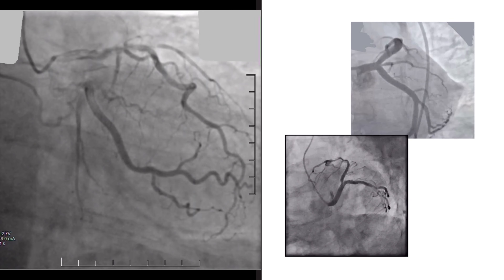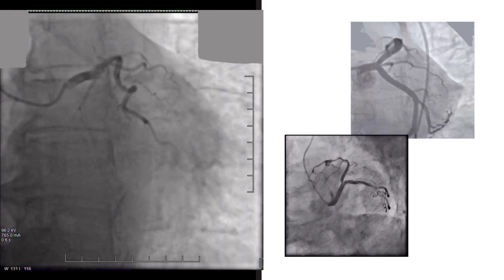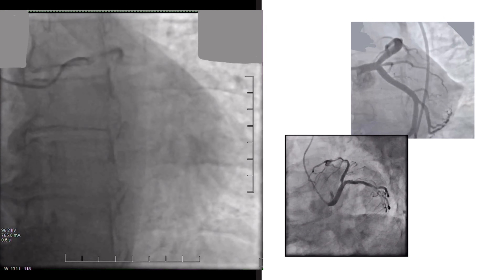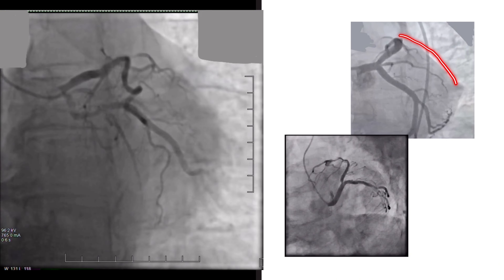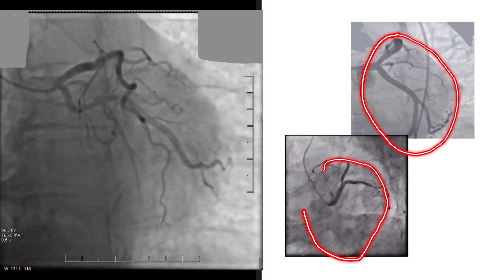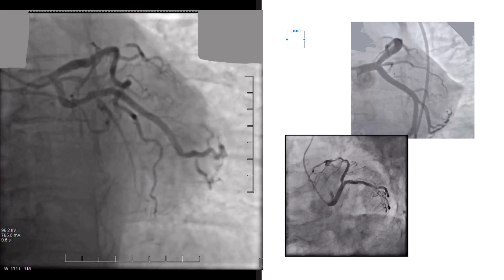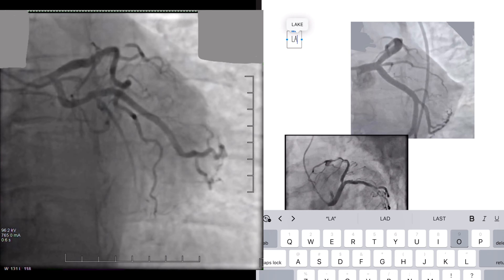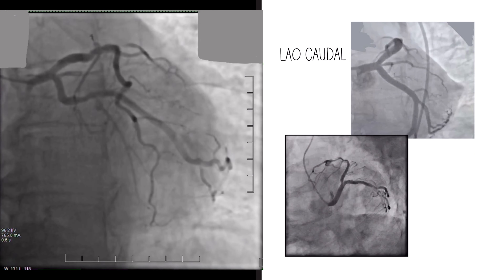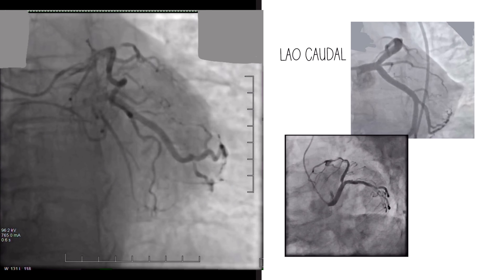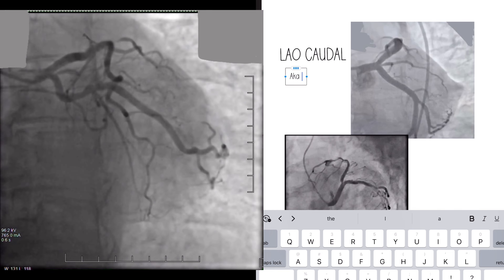Next example: spider view is a little harder to identify just because it's such a unique view, but we're going to try it anyway. Looking at this image, can you see the heart shadow? So that's the heart shadow in LAO. Spider view is LAO Caudal — it's one of the only views we really have a nickname for, which is why it's important to know what spider view actually means so that when you're asked, you don't wonder whether spider is LAO or RAO. It's LAO Caudal, also known as spider view.